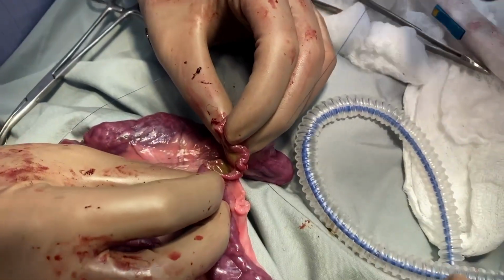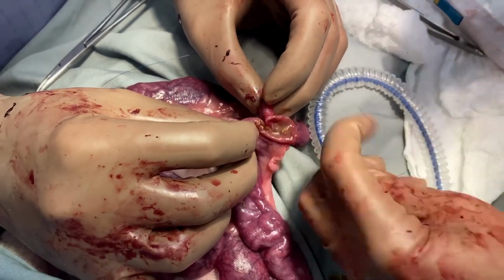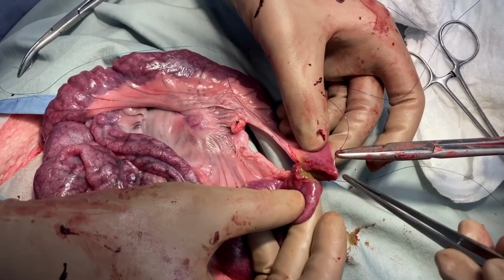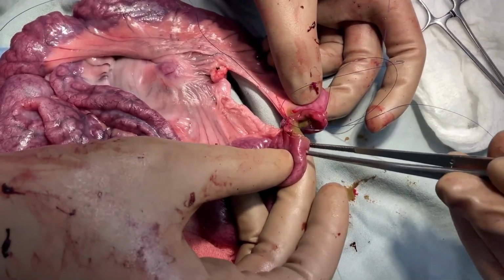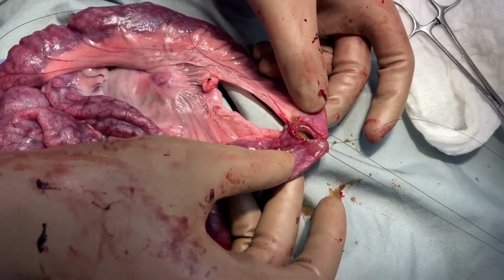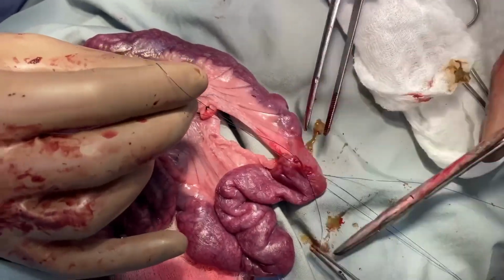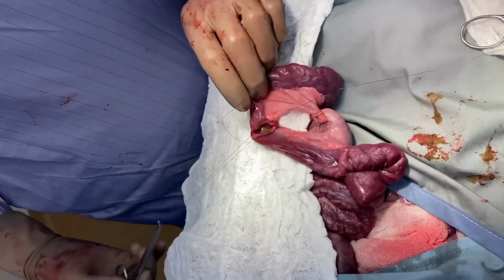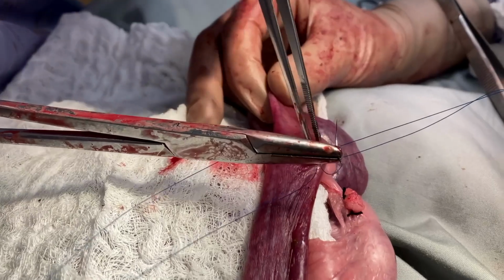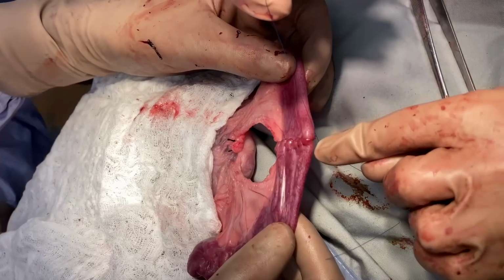Place a suture through the mesenteric borders of both bowel ends and tie a knot. Place stay sutures through the anti-mesenteric borders of both bowel ends. Then, run each suture towards the anti-mesenteric border with one anastomosis on each side. Tie the sutures when they meet at the anti-mesenteric border.